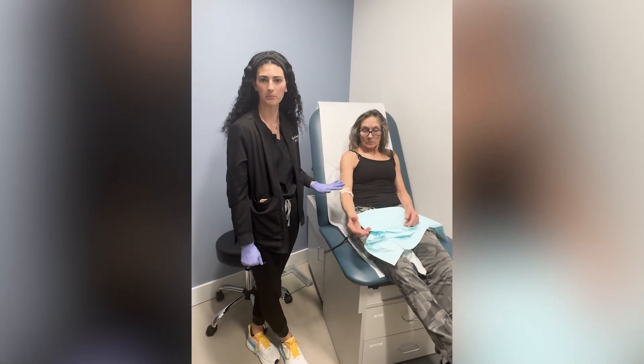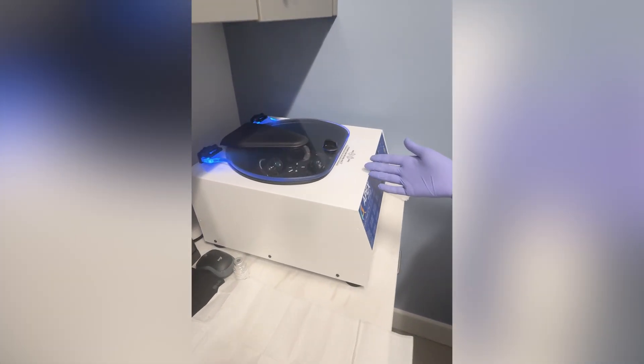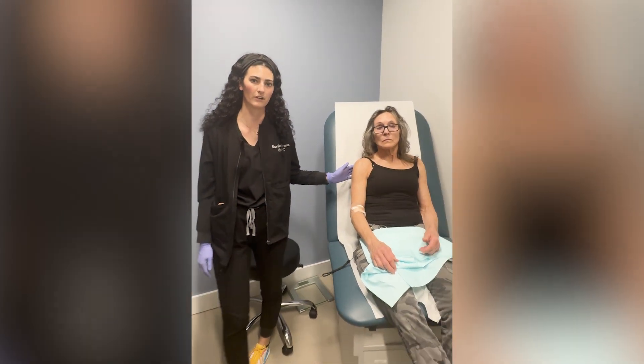So we are doing PRP for the shoulders. We've taken her blood already and we're actually spinning it down right now in the centrifuge. It will separate the red blood cells, the white blood cells, and the platelets, and then from there we will inject it back into the shoulders, the joints, and the rotator cuffs.